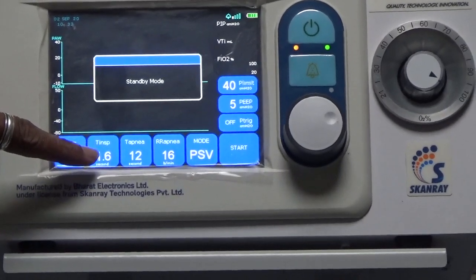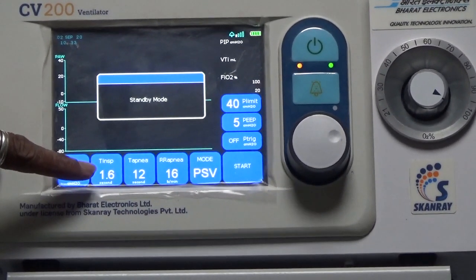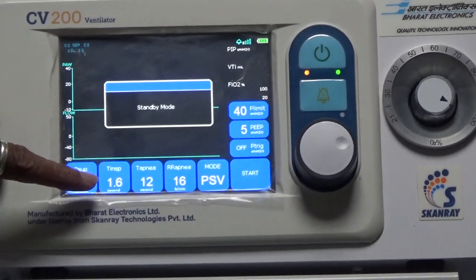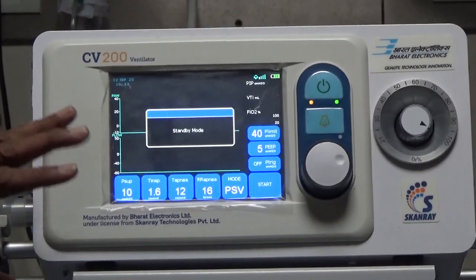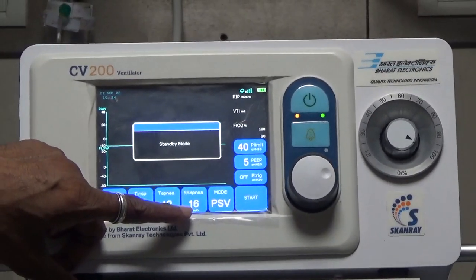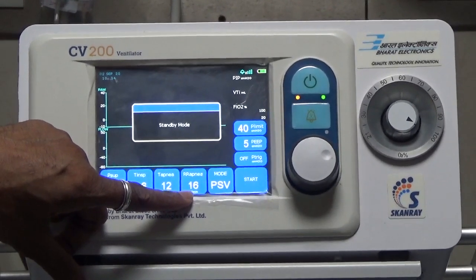The T inspiration it shows you here is the default T inspiration beyond which the machine will cycle off. This is a safety feature. This is not inspiratory time. In pressure support, there is no inspiratory time. This is, of course, the apnea respiratory rate, which is set at 16 per minute. That is good enough for us.